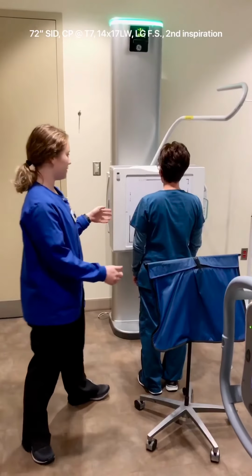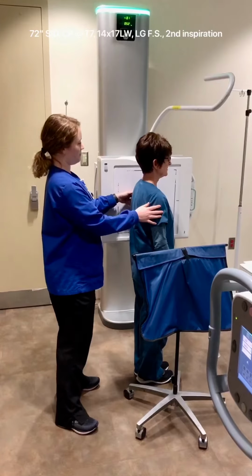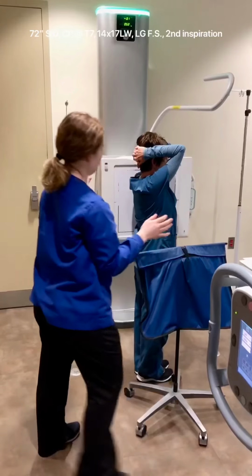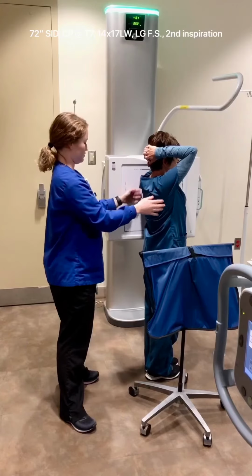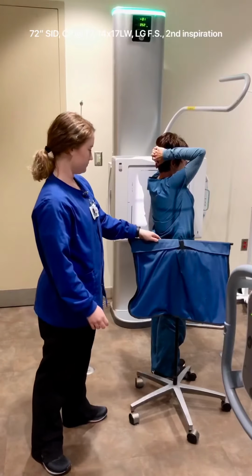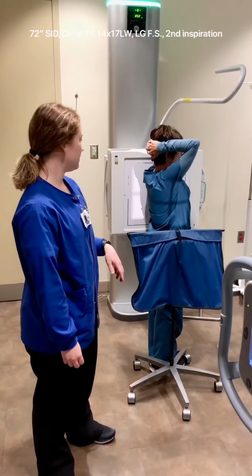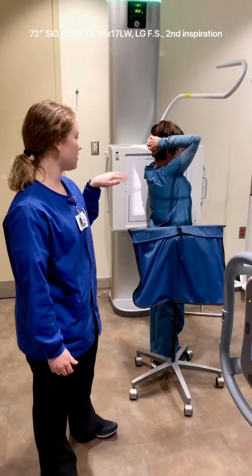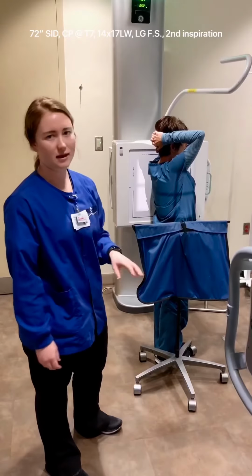So you're going to have your patient turn so their left side's against the board, and then put your hands on the back of your head with your elbows facing forward, and go so you're close to the board, but you don't have to force your hips into the board. Make sure you use your shield. You also still need 72 SID, and normally for the average patient you need to drop the collimator, drop the tube and the bucky down about an inch.